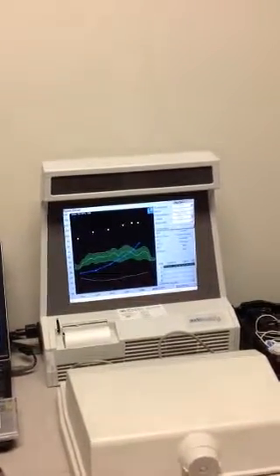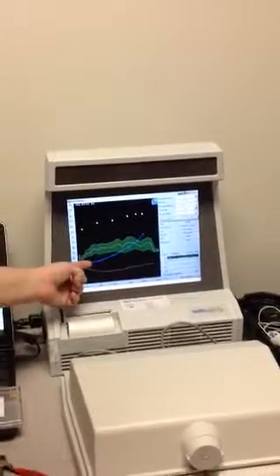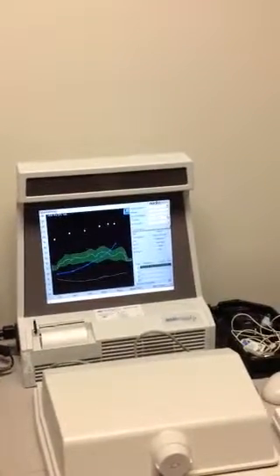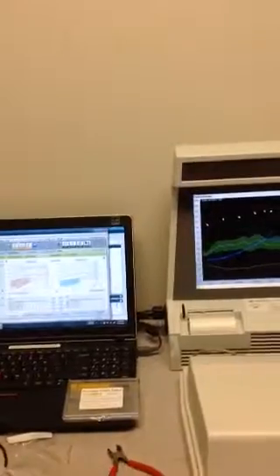Where do you want it for soft? For soft, if you're matching to sensation level, you want the soft inputs to be at threshold. So that line would be down here. Okay. I can try and turn it down to get there, but chances are her ear mold acoustics won't allow it. So I'm going to run it one more time.